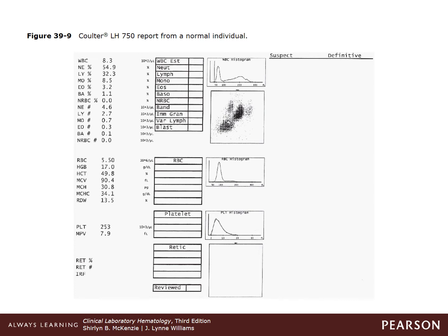And if all the data point to the measured presence of nucleated red blood cells, the number of nucleated red blood cells per 100 is derived from the data calculated or collected by VCS technology and then plotted here.